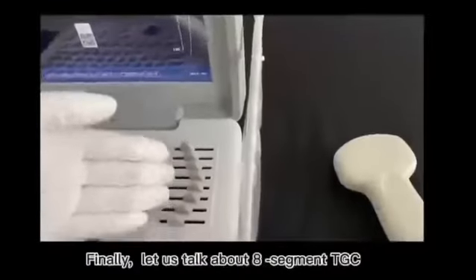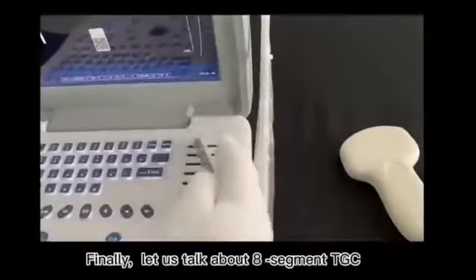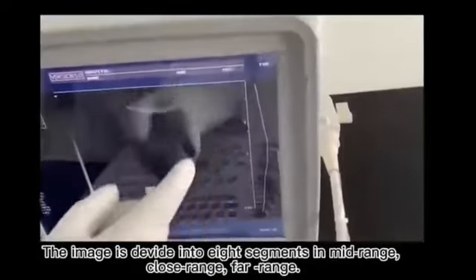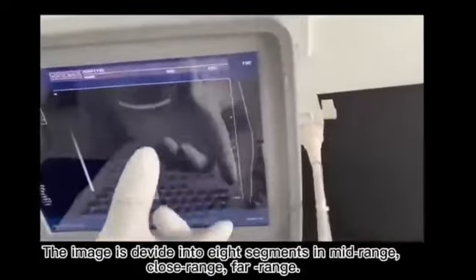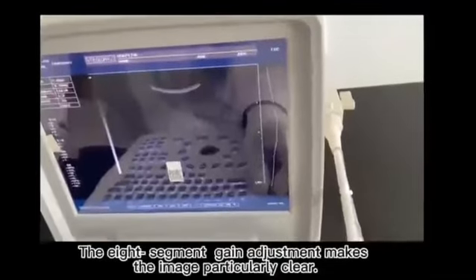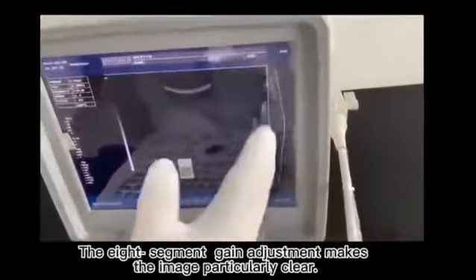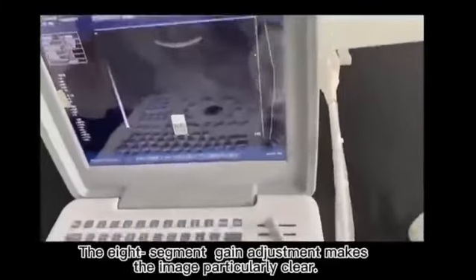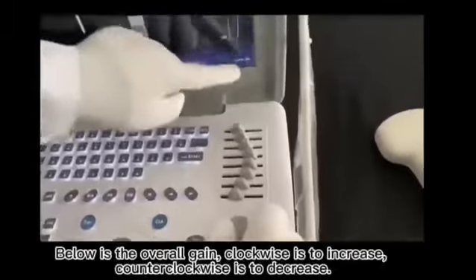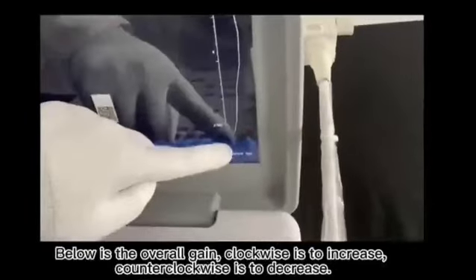Finally, let us talk about 8-segment TGC. The image is divided into 8 segments in mid-range, close range, and far range. The 8-segment gain adjustment makes the image particularly clear. Below is the overall gain. Clockwise is to increase, counterclockwise is to decrease.